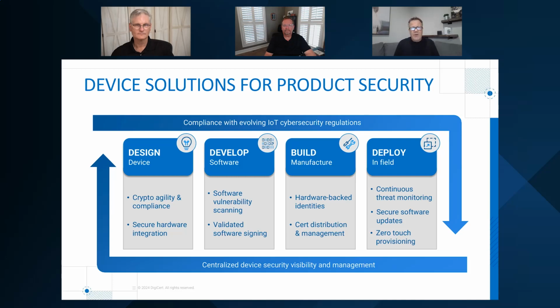Is the software on that device really tightly integrated to that particular device? And then when the software is developed, are we using software from trusted sources? Are we using third party libraries, open source libraries? Are we writing it ourselves? Is it being scanned by tools that developers would use to scan for vulnerabilities and secrets?